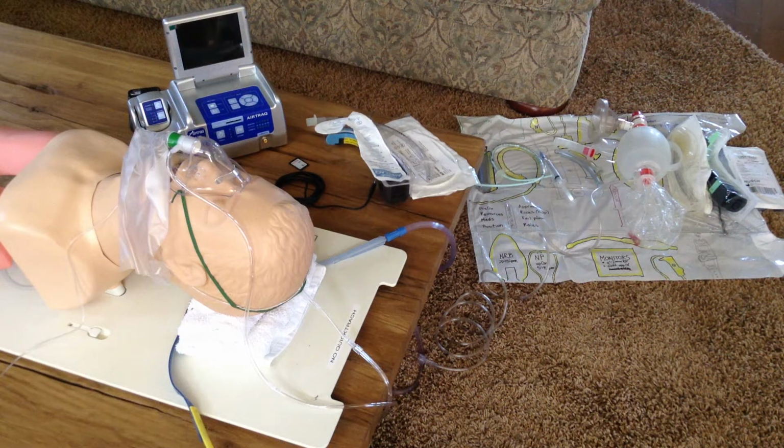So we're going to go over video Airtraq intubation. We've got our usual setup for intubation. We've got all the equipment set up. The patient has been prepared. That includes being pre-oxygenated with denitrogenation, and the SATs are maximized. We've got apneic oxygenation ready to go.